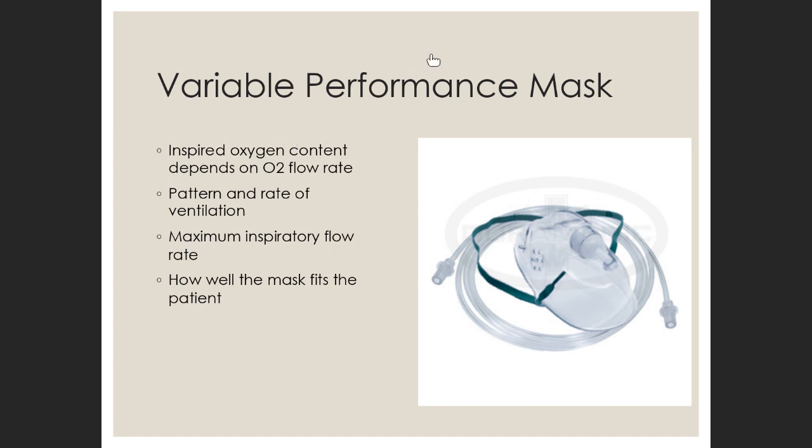They call them variable performance masks because the FiO2 varies according to the flow rate, the pattern and rate of respiration of the patient, how well the mask fits, etc. So when you are an intern and you see a patient in distress, and you check the SpO2, the saturation, and you decide that a patient needs oxygen, and you've taken a history, and you realize that the patient is not a chronic obstructive airways disease patient and you're going to put them on oxygen, you need to ensure all of these.